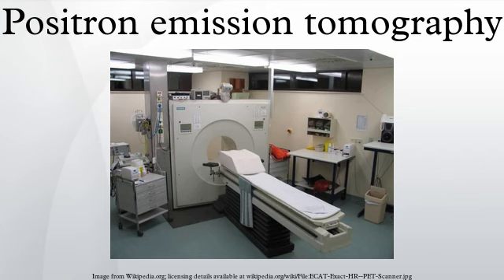A miniature PET tomograph has been constructed that is small enough for a fully conscious and mobile rat to wear on its head while walking around. This rat cap allows animals to be scanned without the confounding effects of anesthesia. PET scanners designed specifically for imaging rodents, often referred to as microPET, as well as scanners for small primates, are marketed for academic and pharmaceutical research.